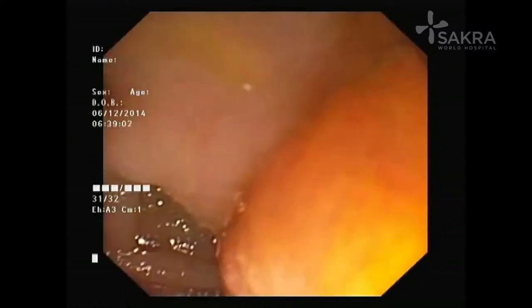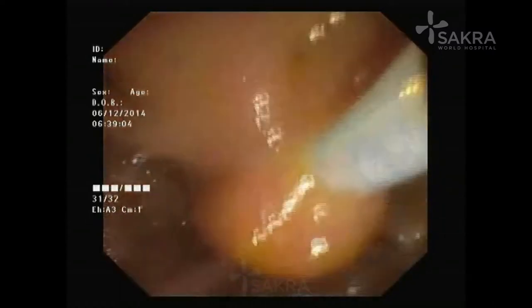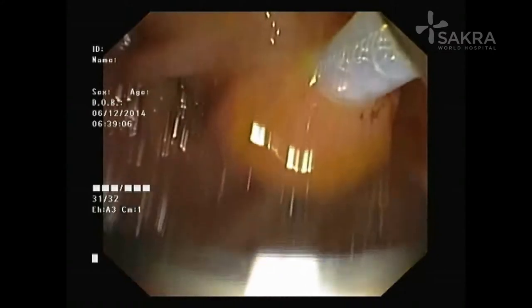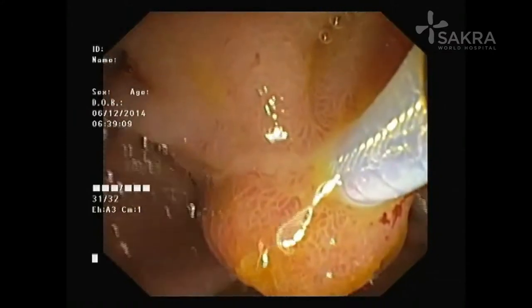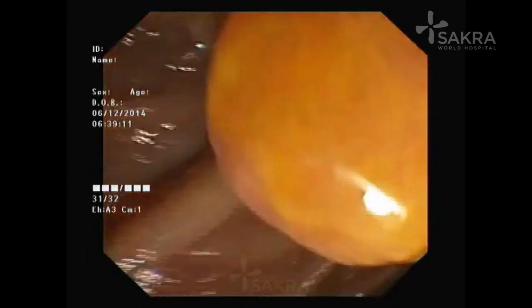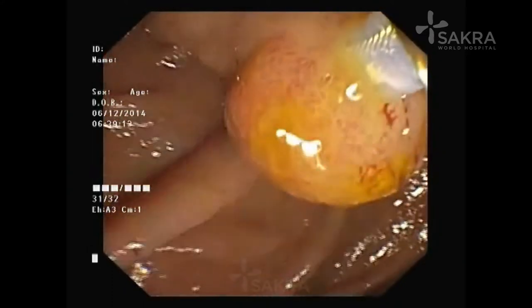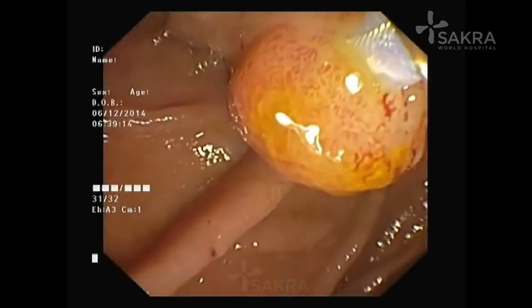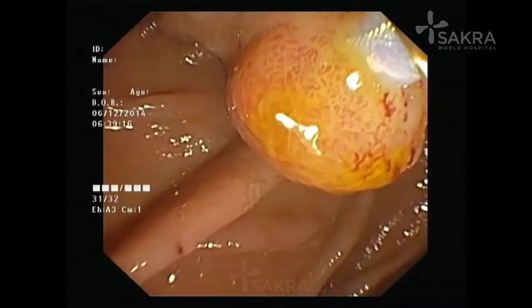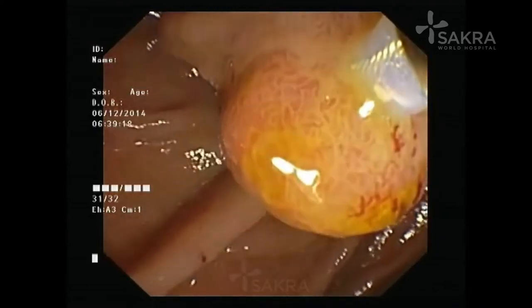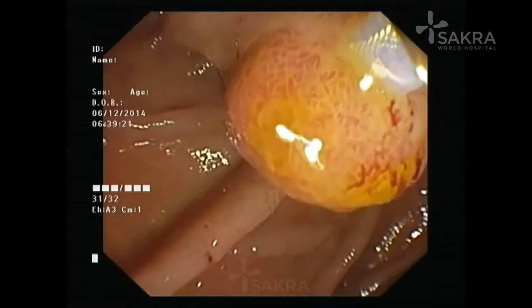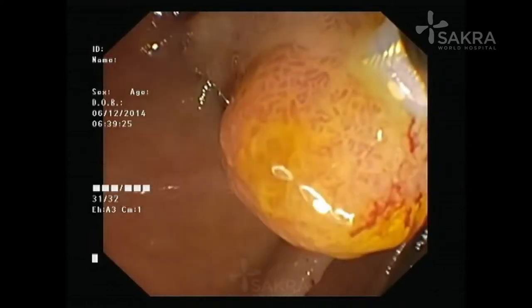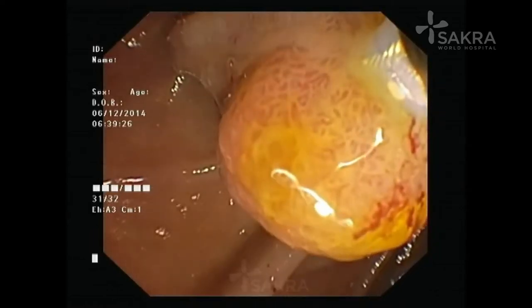Using monopolar diathermy, we are passing a snare through the endoscope. You can see the ampullary tumor has been captured with the snare, and using monopolar diathermy the tumor is being resected endoscopically. The key for endoscopic treatment is that complete removal is a must.